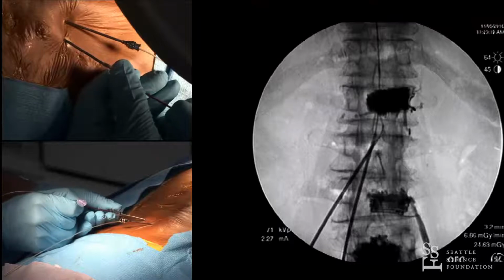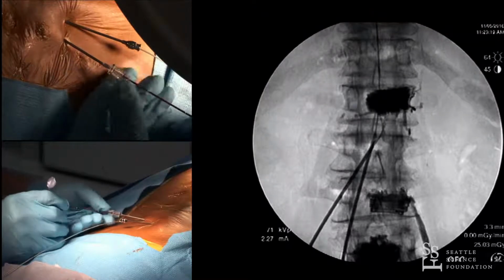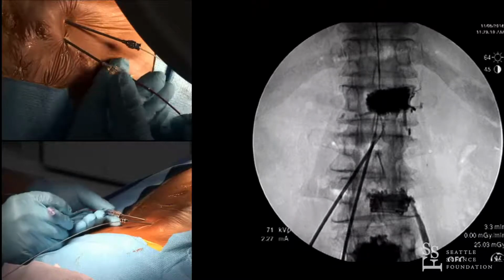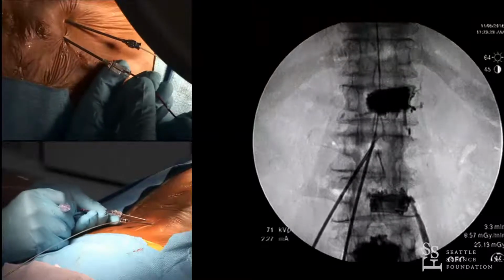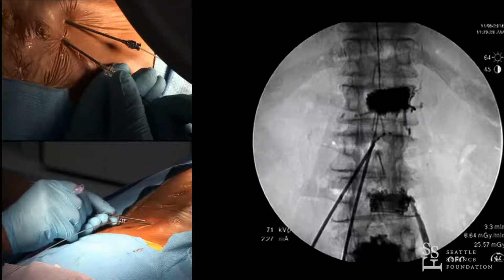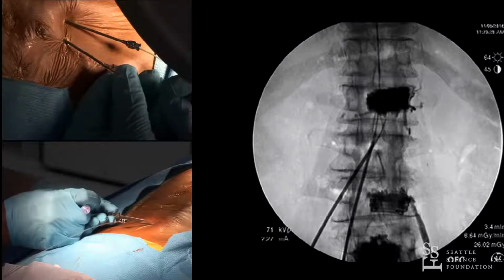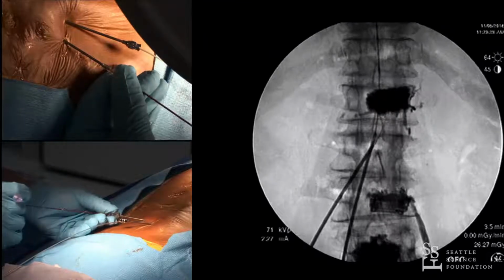Yeah, maybe this level is with this prior procedure, it may not be the best. Because that's too low and it doesn't want to go to where, yeah.